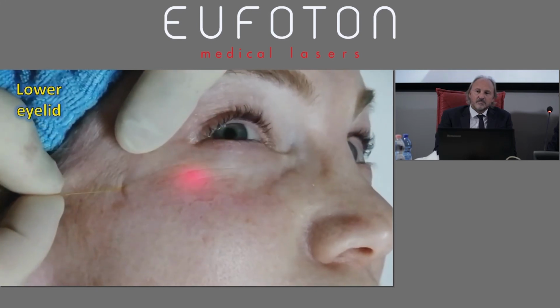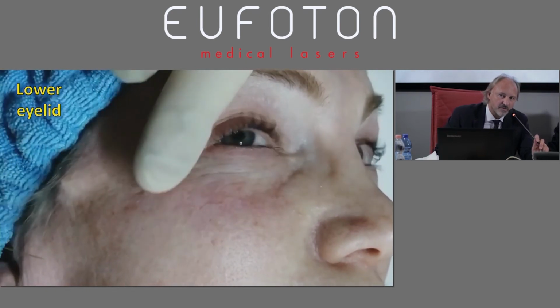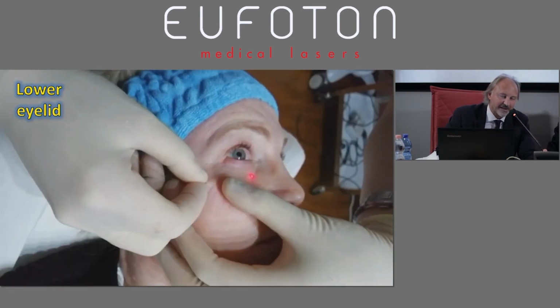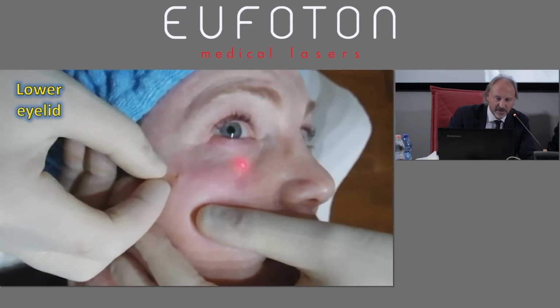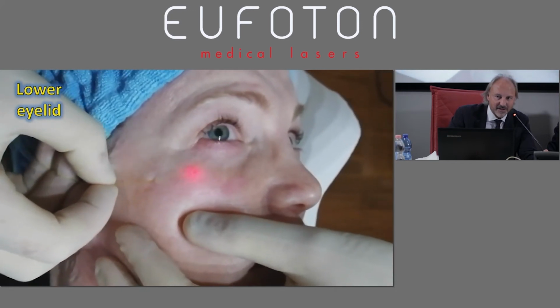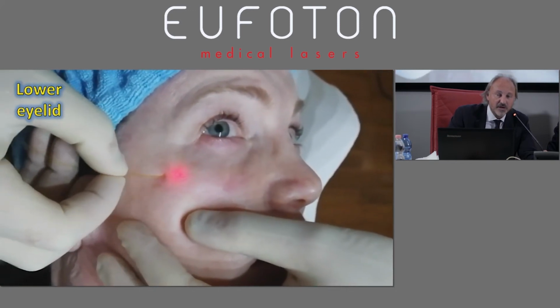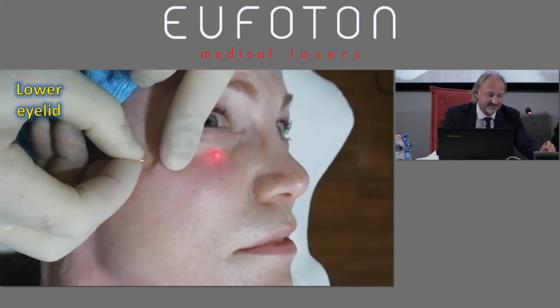I use the cannula for lipofilling. They are thinner, but much bigger than a 25 gauge. Maybe you misunderstood. I also use the lipofilling cannulas, 1 millimeter, 1 Mercedes. Not the filler cannula. I use the filler cannula when I do the infiltration. Okay, got you right now.